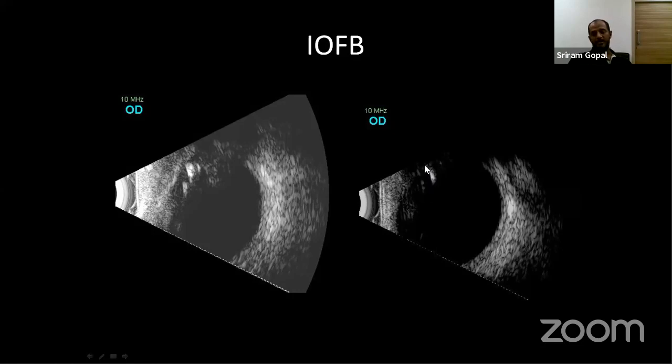Two problems with foreign bodies, as I told you. Because of the resolution of ultrasound, anything less than 1 millimeter in size you will not be able to pick up easily. It's very easy to miss. And second, if it is very anterior, ultrasound is also not a great tool to pick up an intraocular foreign body. A lot of times these persons, if they come early, have an open globe, and pressing and manipulating an open globe is not a good idea, because you'll be causing more damage.